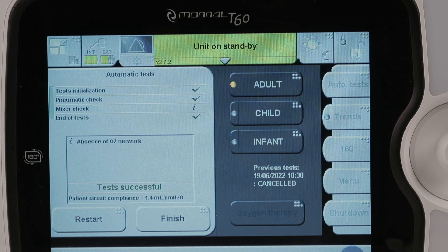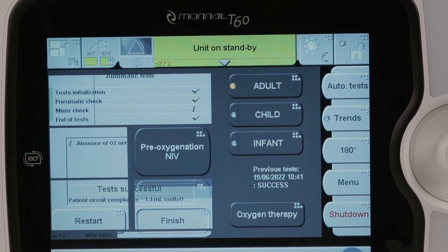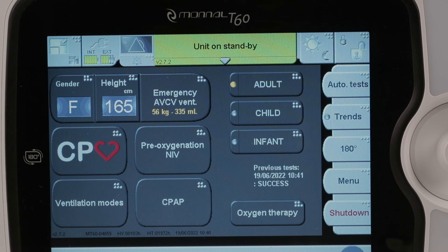Note that it is possible to interrupt the autotests at any time by pressing the stop key. The information indicator informs you about the absence of an oxygen source if you have not connected one. Here the test has passed. We can now start a ventilation. For more information, refer to the user manual.